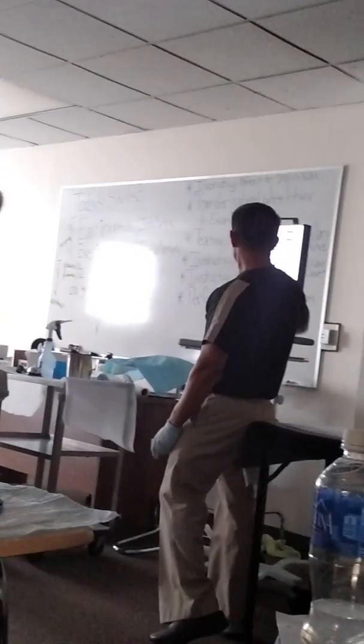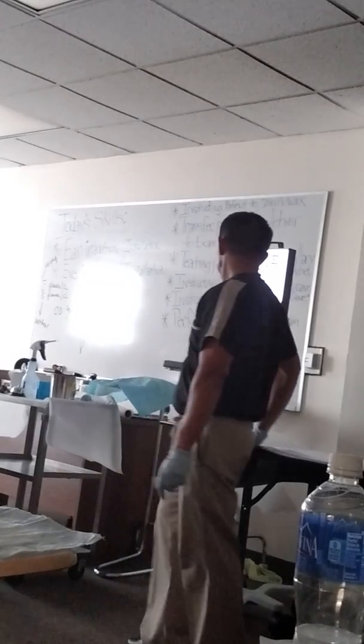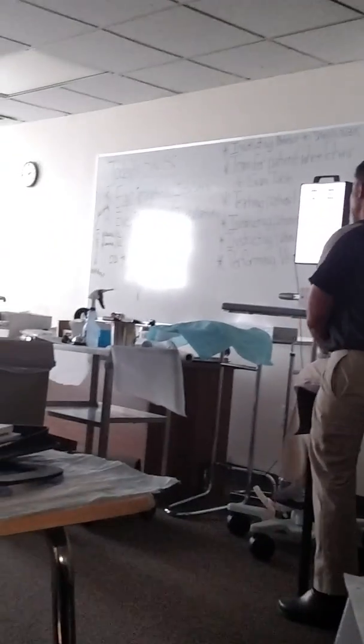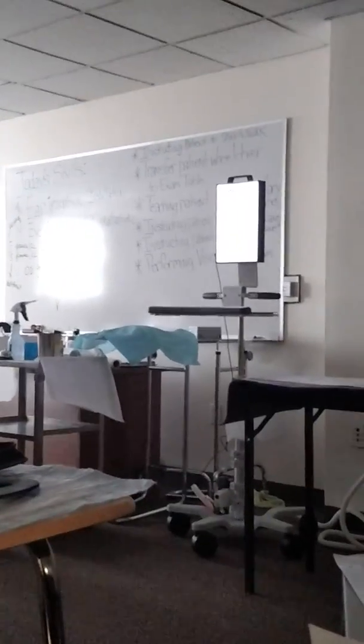Okay. All right. So tell me which line can you read below the red line? Foxtrot, Papa, Charlie, Delta, Tango, Lima, Echo. Okay. Wow, it's good. So you have what line? That was the bottom line. The bottom line, 20/15, with a pinhole. So I'm just going to put here 20. Okay, how about the line above that?